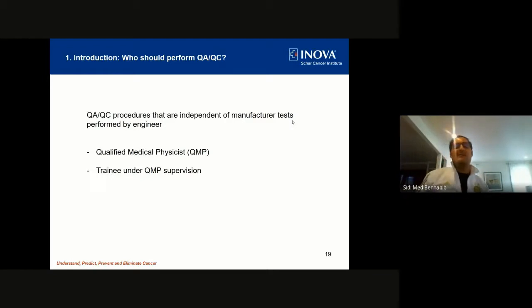And this is what therapists do every single day. Radiation therapists perform the daily QA here in the United States. It's not physicists who do that. So radiation therapists do it. And then physicists basically come in the morning and check the results and check everything. And also a trainee is not only a radiation therapist, but a physicist as well. Next slide, please.